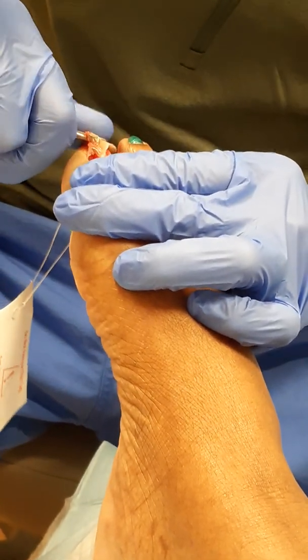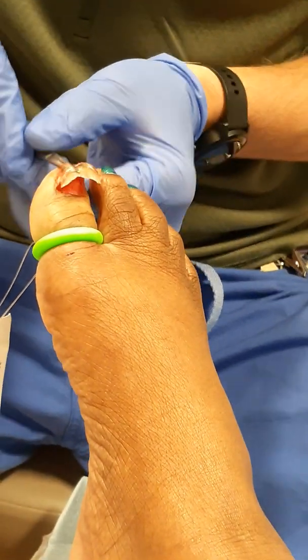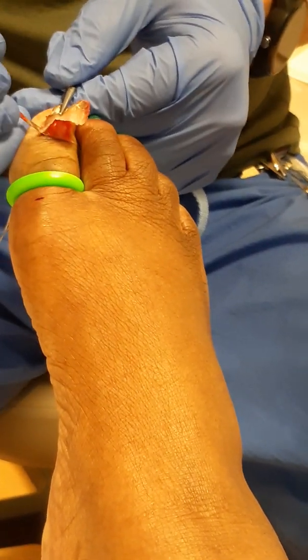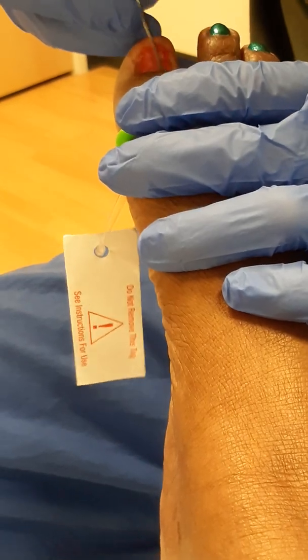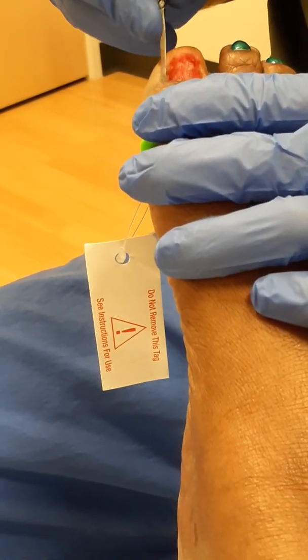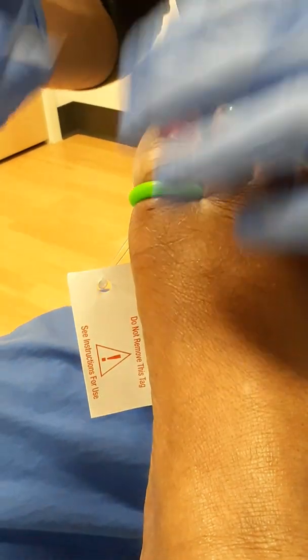Alright. And that is out. Let me just free up this little piece of tissue. I was able to watch this. Yeah, pretty cool. There you go. Nails off. Woohoo! Doesn't look that bad. Nope, right? Looks cute, kind of. Didn't look as bad as I thought it would look. I thought it was going to look all gross and ugly. No, underneath it usually looks pretty clean.